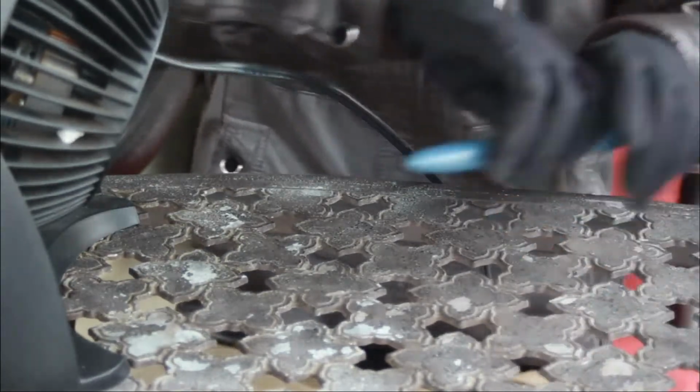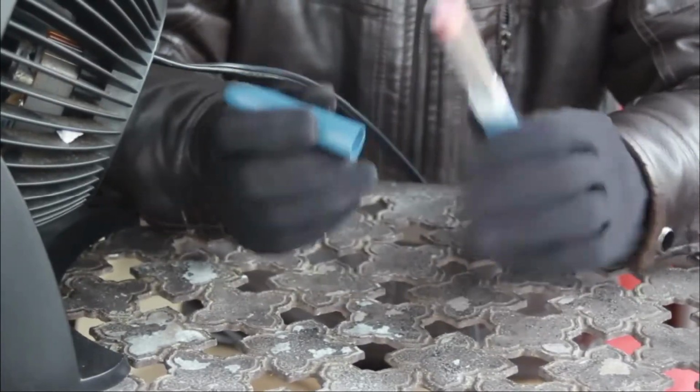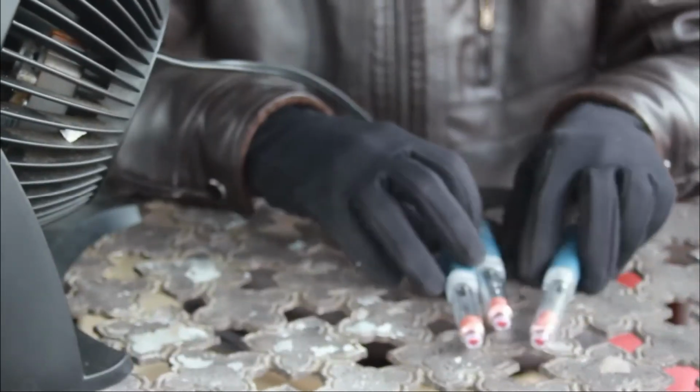And in the meantime, we already peeled the stickers off of these. We're going to go ahead and take the caps off and throw them in this little Tupperware container right here. So we're going to do that for all 3 of them. Cap off, in the Tupperware, cap off, in the Tupperware. Okay, so now we got that done.